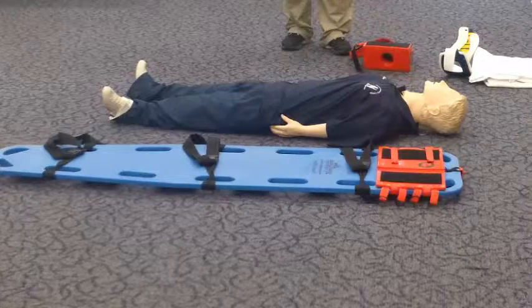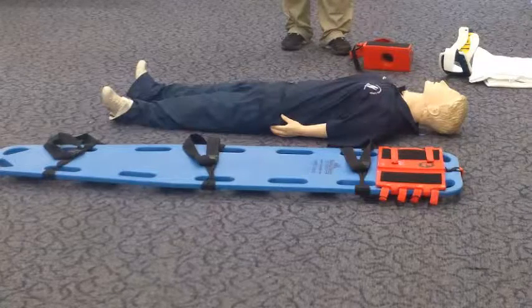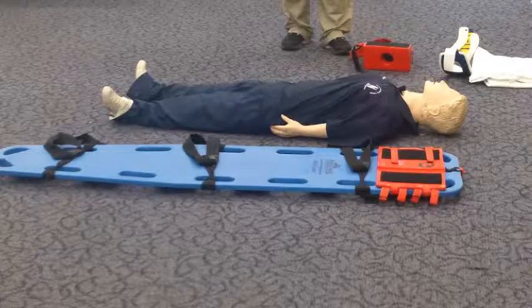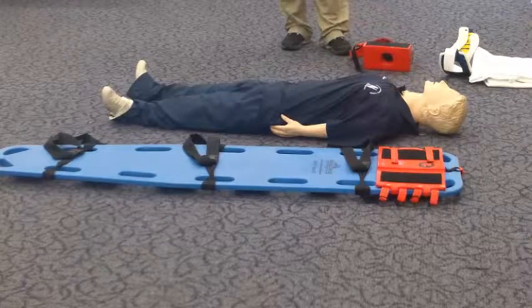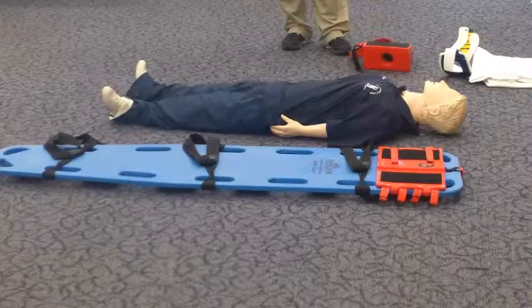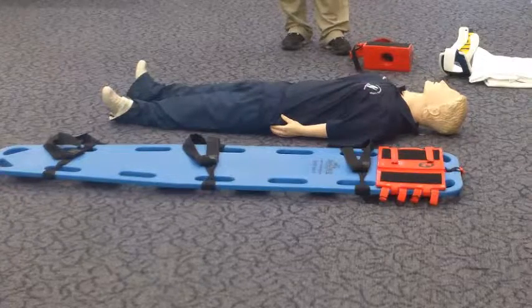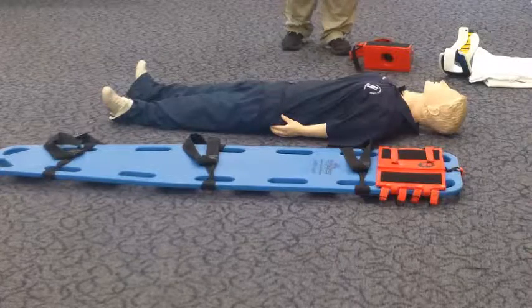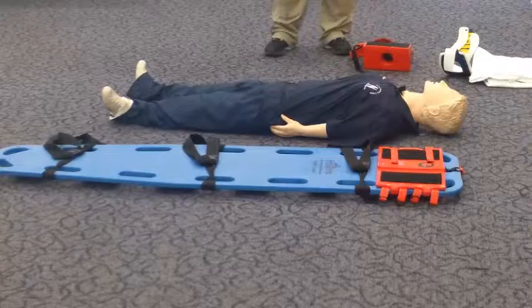When moving the simulated patient to the device, you should use the help of the EMT assistant and me. The assistant EMT should control the head and cervical spine of the simulated patient while you and I move the simulated patient to the immobilization device. You are responsible for the direction and subsequent actions of the EMT assistant and myself. You may use any equipment available in this room.